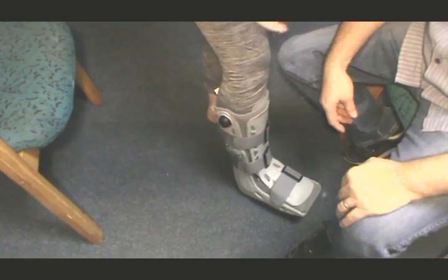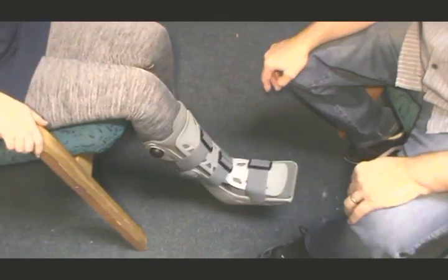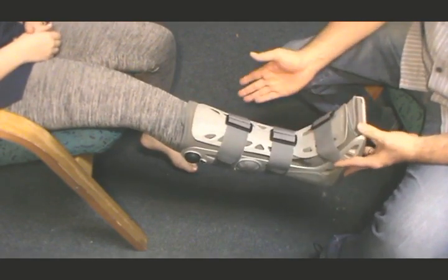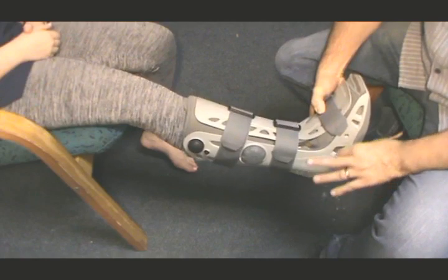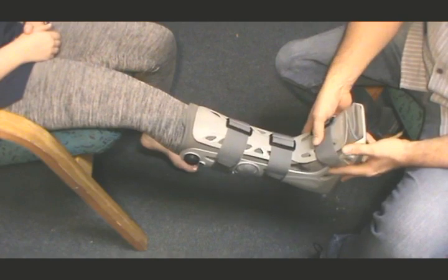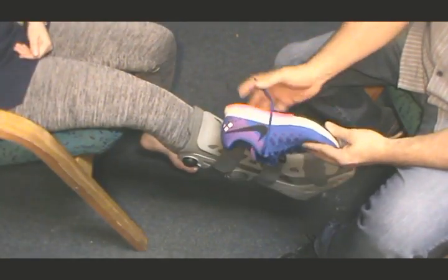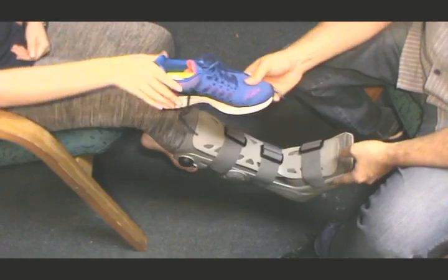That's fine. And that's it. And just please have a seat, Amy. So I'm just going to show also. It is advisable that because of the build height of the boot, it's quite high, you need to make sure that you're balanced on the other foot. So it would be better to get a shoe that is as high as possible for the other foot. Try not to use sandals or slops, because it will make you unstable. So try and use a pair of tackies like Amy's got here. She's got a nice pair of tackies with a good build height there. And a good pair of tackies will definitely help.